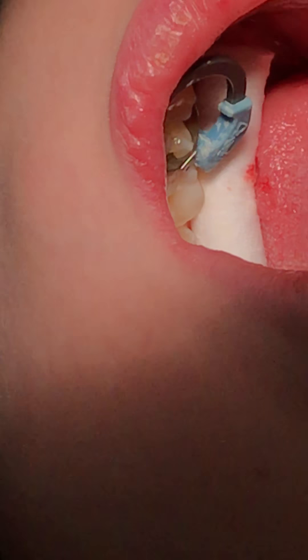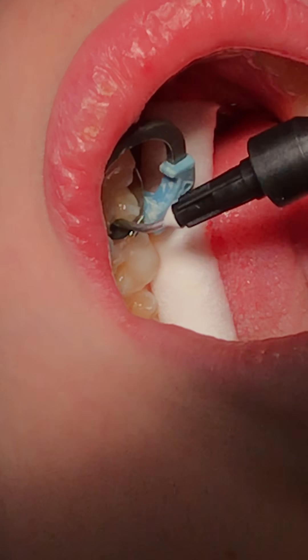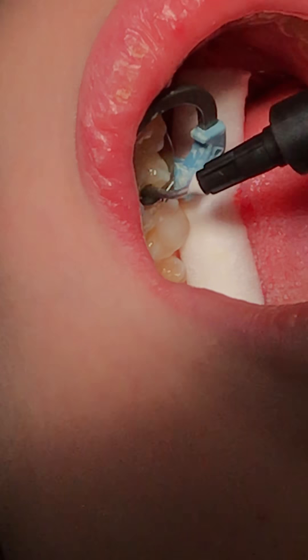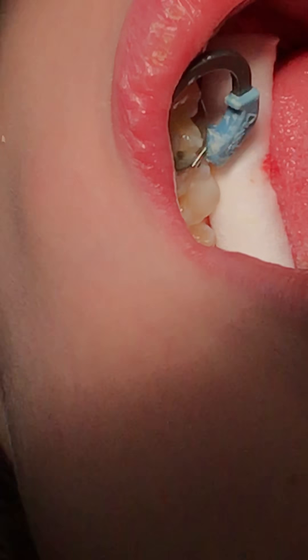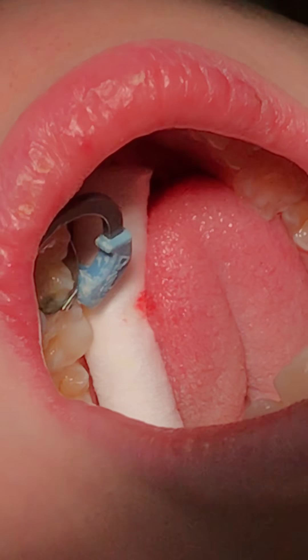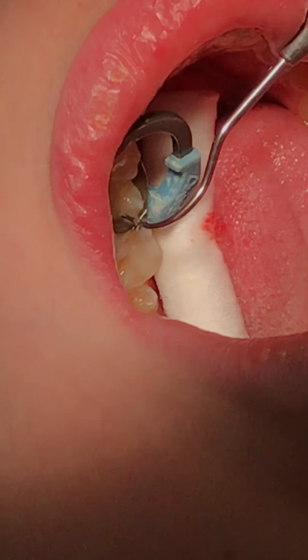We got that so we can proceed with our restorative material. I'm going to get the proximal floor with this flowable and get the side situated. When I place the cannula in there I don't want any bubbles, so I'm going to try to get on the sides like that and lift it out, and make sure that everything is contoured and adapted to the walls — still nice and flowable, right next to the walls like that.